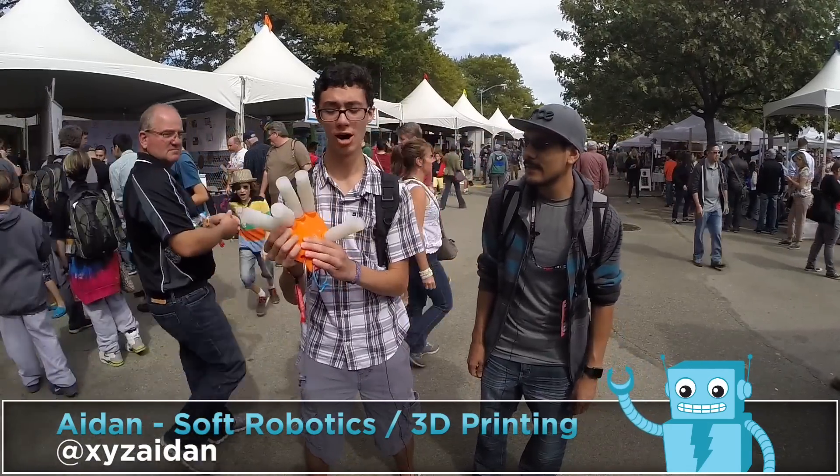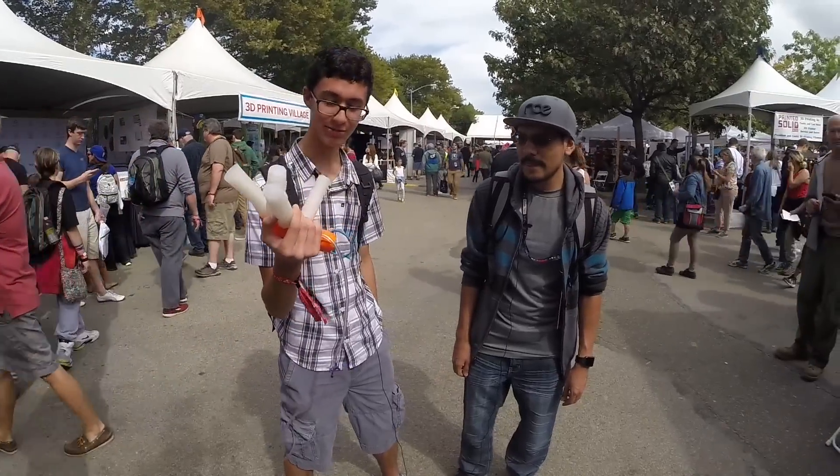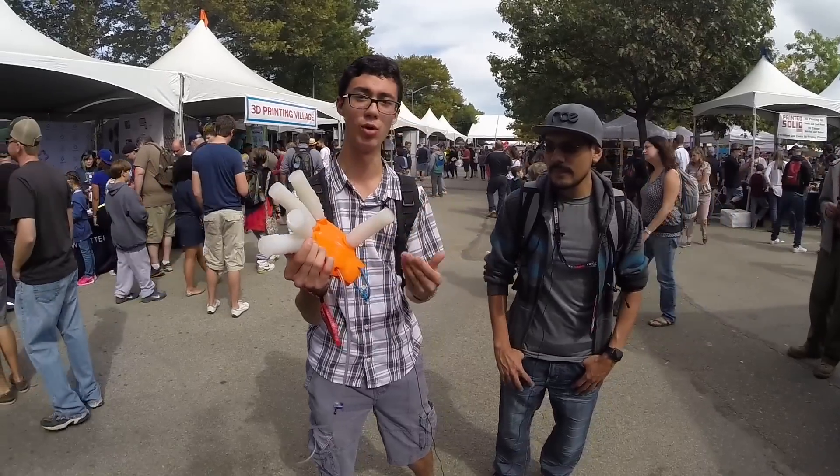I have the first prototype of a soft robotic prosthetic hand that I've been developing for some time, doing some different research in terms of actuators and whatnot.